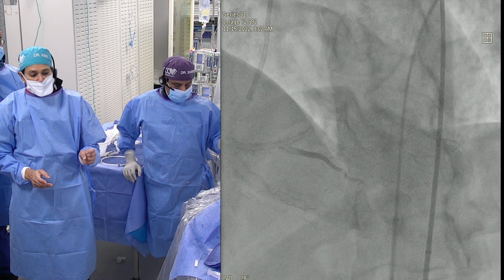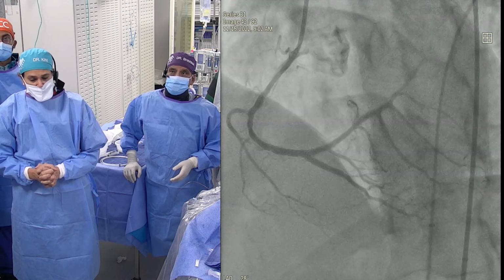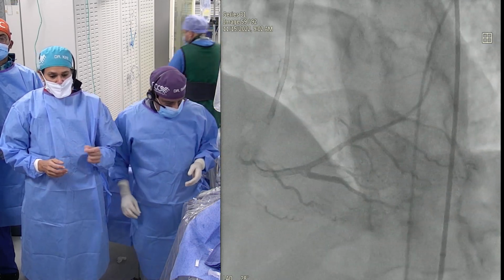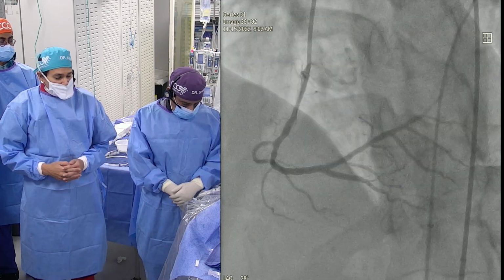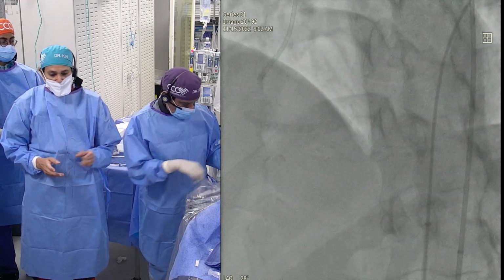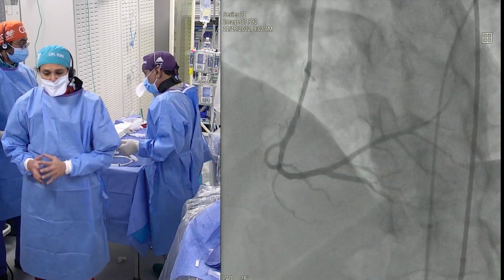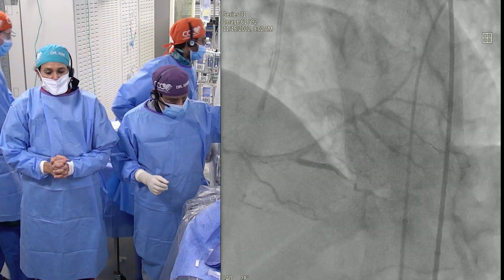I used a stiffer wire because we thought that the ostium had disease, probably 95% or maybe a subtotal to 100% ostium. So we used a stiffer wire. If not, you wanted to try with the softer wire tip, Fielder, Whisper. With Fielder we tried. If not, Whisper also would be okay. Now same thing. Once we entered, if you think we are in the subintimal, then you escalate there. So you are into the lumen of the PDA, and then of course balloon and keep both the branches intact.